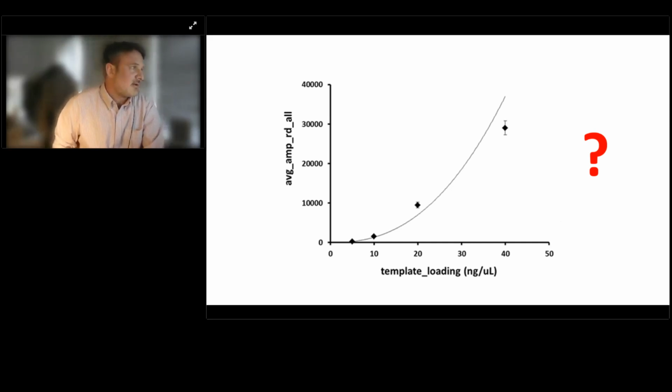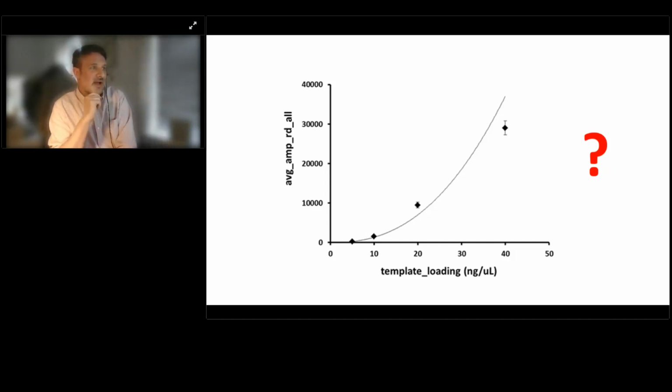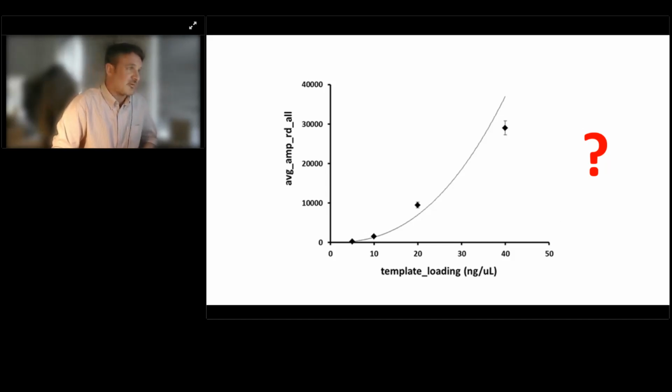I think this is a really nice demonstration of the coverage that we got, but what I can't give you an answer for today is why, when we increase the loading mass, we actually get better coverage of individual amplicons. This is despite the fact that there's a step within the protocol where you dilute your library down to 50 picomolar, which is your optimum sequencing concentration. Even though we do that, we still see that with a higher loading mass, we get much better coverage across the amplicons. And we've settled with a 30 nanogram load for our particular assay after playing around with the parameters on the PCR.